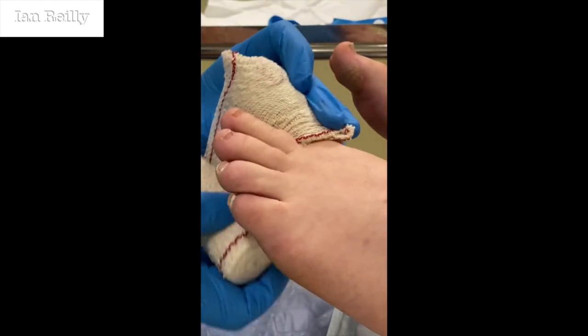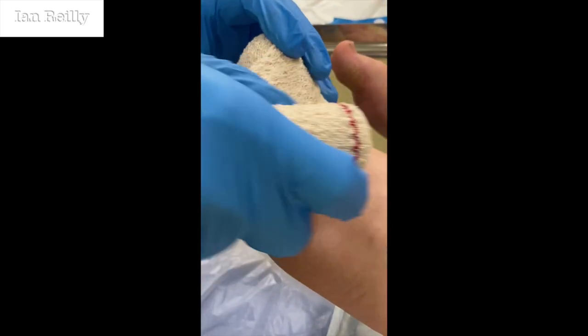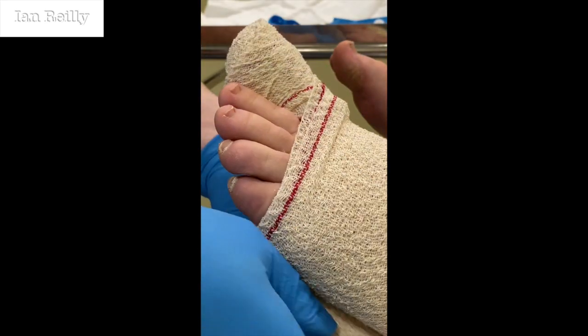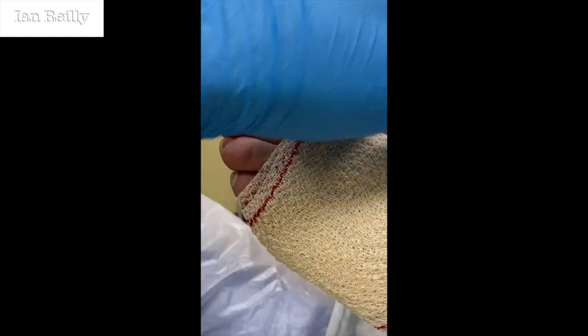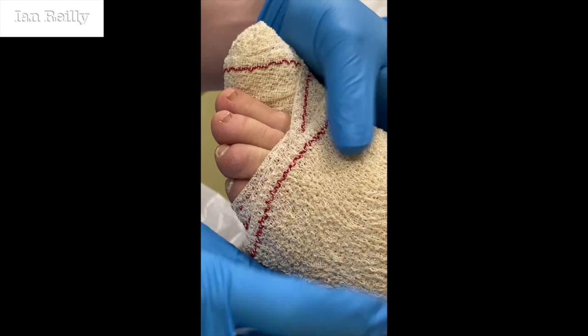And then we put on a dressing sometimes known as a Tom and Jerry dressing. Now you're too young to remember Tom and Jerry, but when I were a lad, when Tom banged his toe, he had a big bandage go on his foot. This is now when I look and just check his shoes. So I spoke to Sophie last week and said make sure you're wearing some nice wide shoes, because you can get a little bit of bleeding through. So we like to put a nice big bandage on just in case there's any leak through.